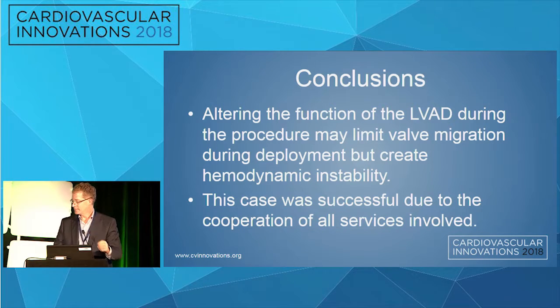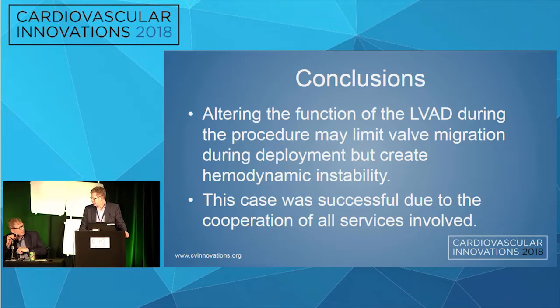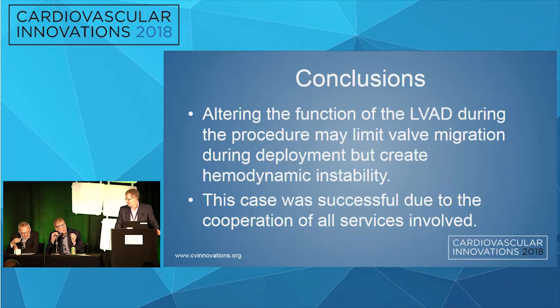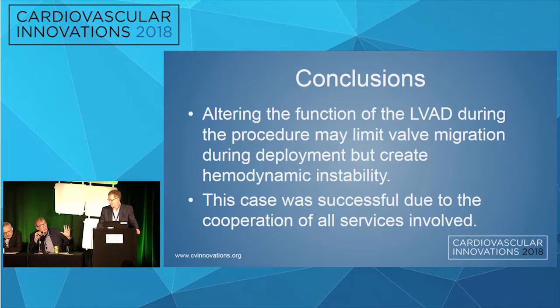This was tough. I mean, last year I showed a case of an LVAD that we actually put 4 valves in because it's so difficult. That was with the legacy CoreValve. So what was so amazing with this case is that with the Evolut, it seemed as if you had better repositionability and you had more control.